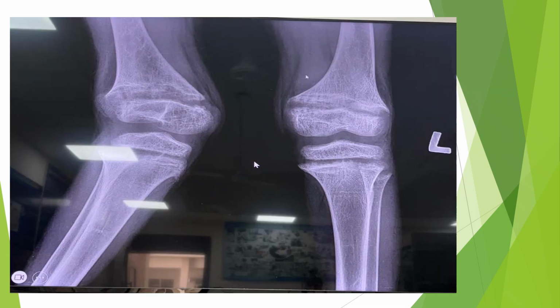Now, if you see this case, here we are able to see the lower end of femur appeared. So that appearance is 9 months of intrauterine life. Fusion is 18 to 19 years. Similarly, you can see the upper end of tibia has also appeared.